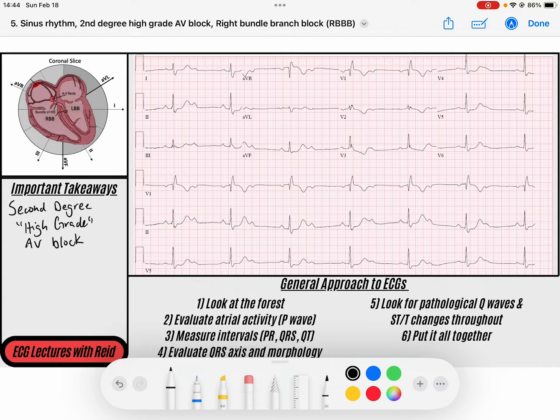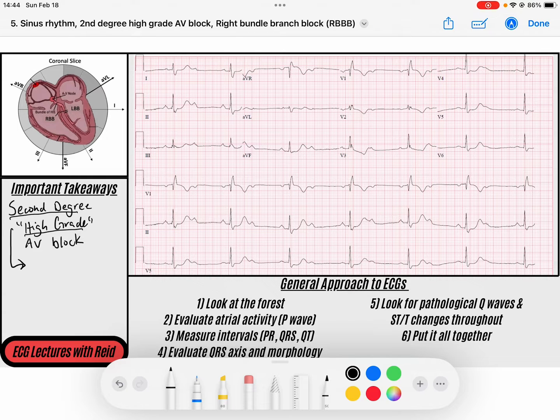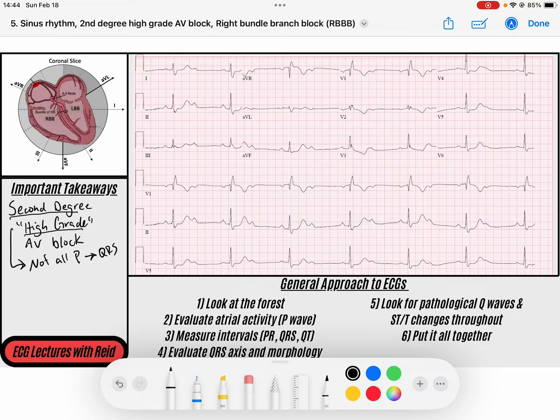Hey everybody, welcome back to the channel. My name is Reed, and today we're going to be going over our last type of second degree block, which is a second degree high grade AV block. Remember that second degree AV blocks are when not all P waves, which are atrial contractions, conduct to a QRS complex, which is a ventricular contraction. We have type 1 and type 2, covered in previous videos.